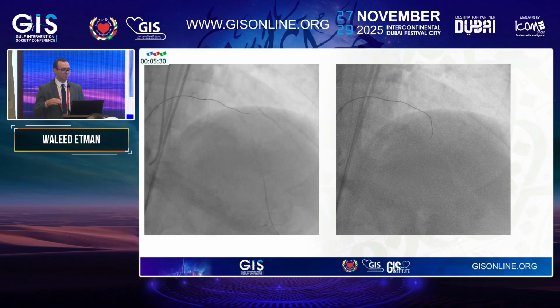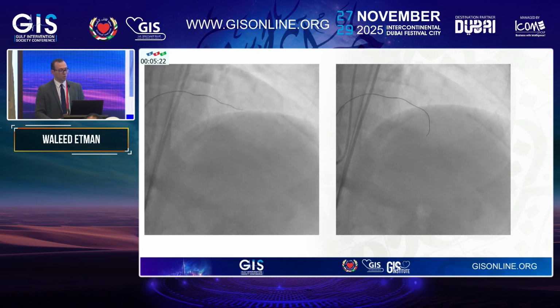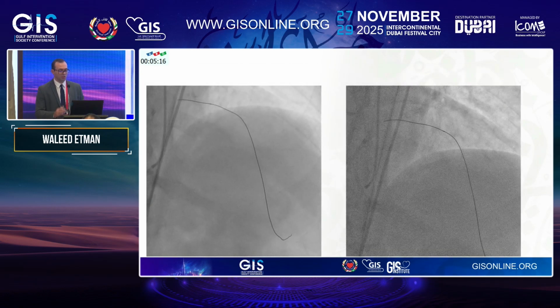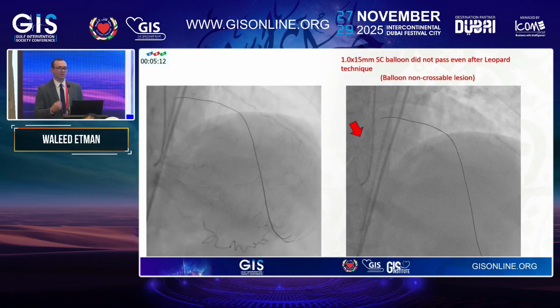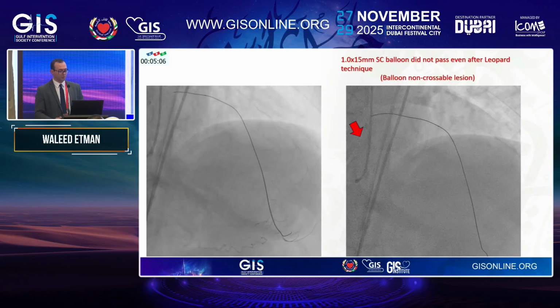Every time the wire passed into a branch, I felt a little bit assured that this is the true lumen. Sometimes it goes in a diagonal, another time in a septal. We always confirmed by a contralateral injection from the right side. We can appreciate we are here in the true lumen, reaching the very distal end of the LAD. Now we tried to pass a 1.0 balloon, and you can appreciate it didn't pass. So we decided to do a grenadoplasty.